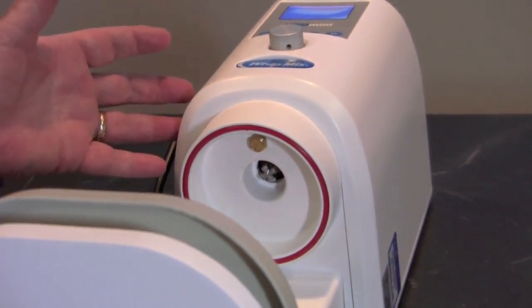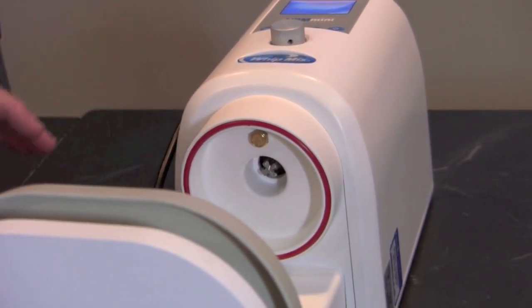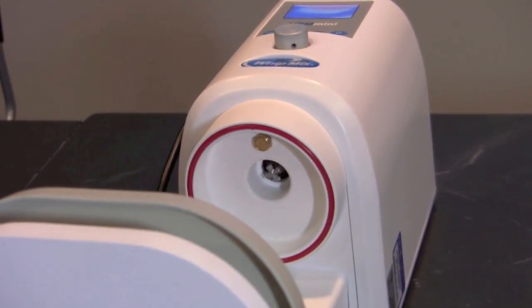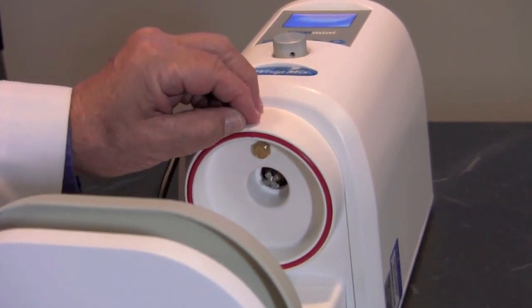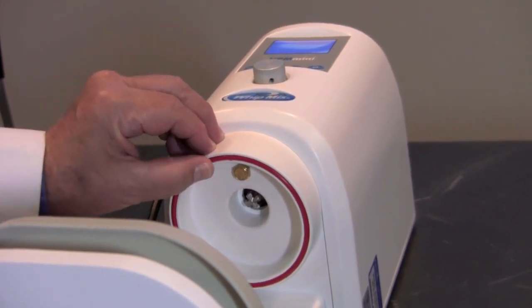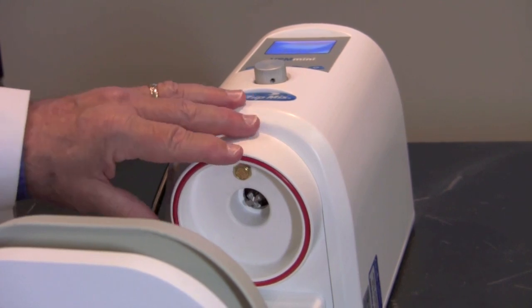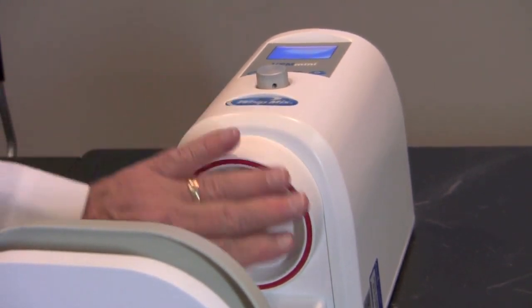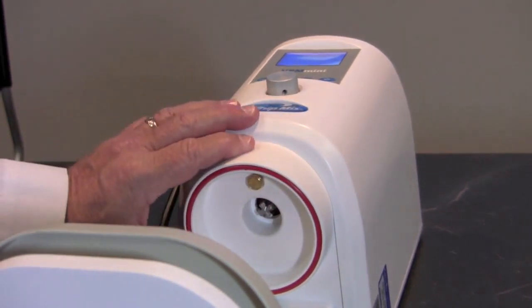Now that we've discovered that the machine is alright in pulling a vacuum, there are two other places we need to check. The first is the rubber O-ring that goes around the throat. If this has gypsum or investment material caked into it, it can be preventing a vacuum seal to the lid of the bowl. So we want to make sure that this is completely clean and that it is seated all the way properly.